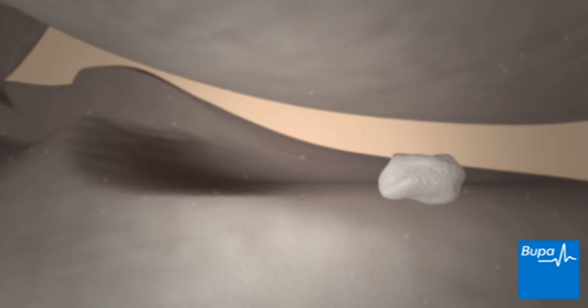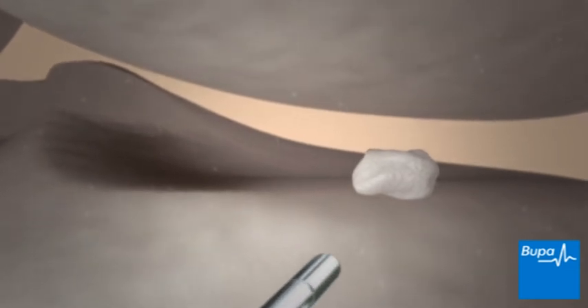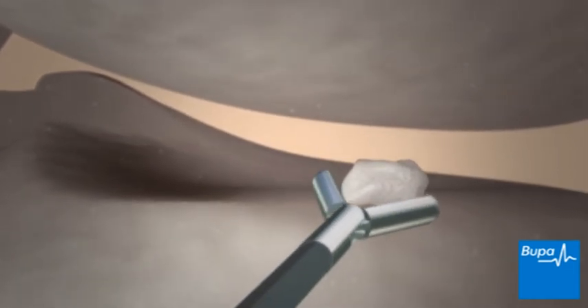Your surgeon will look inside your knee joint to see if there is any damage. Your surgeon may pass instruments through the third incision to repair damage or remove material that interferes with movement or causes pain in the knee. Your surgeon may also remove tissue if it's affecting the movement of your knee.